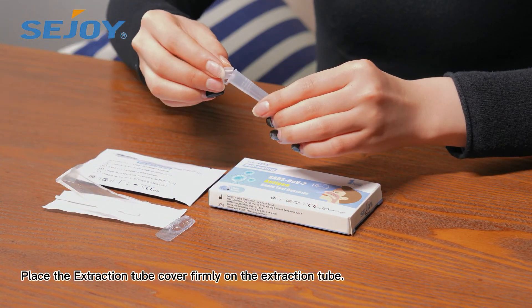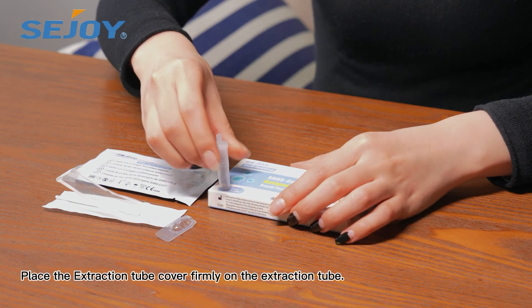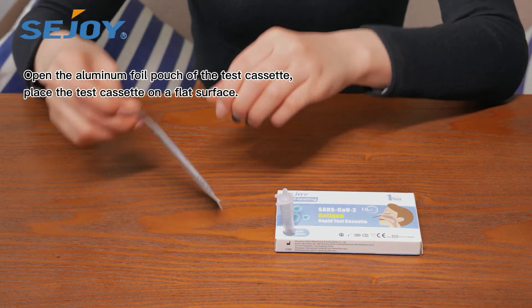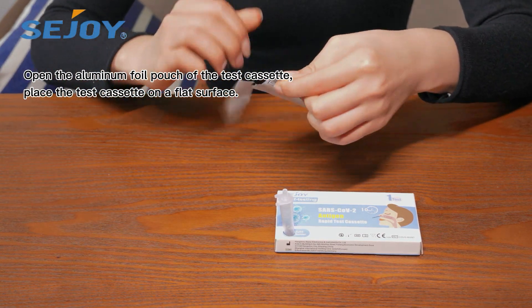Place the extraction tube cover firmly on the extraction tube. Open the aluminum foil pouch of the test cassette and place the test cassette on a flat surface.